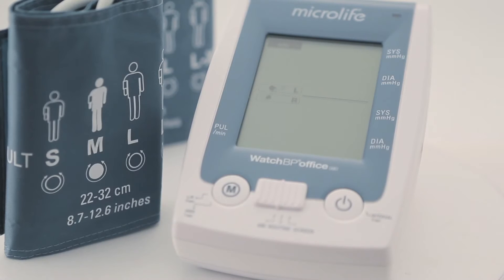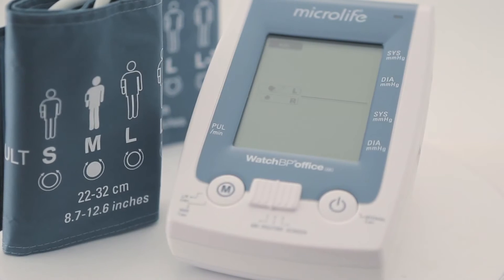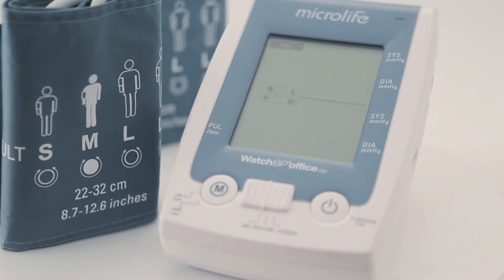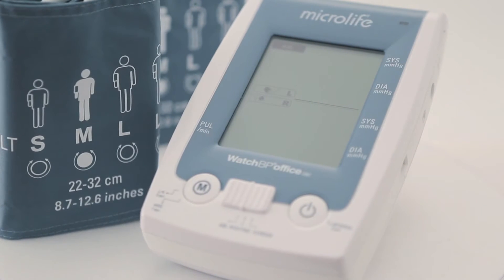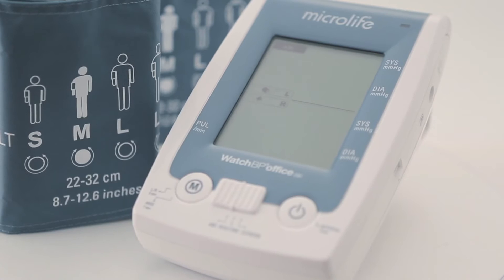Watch BP Office ABI is a cardiovascular screening device — a dual cuff blood pressure monitor with atrial fibrillation detection and ankle brachial index function.